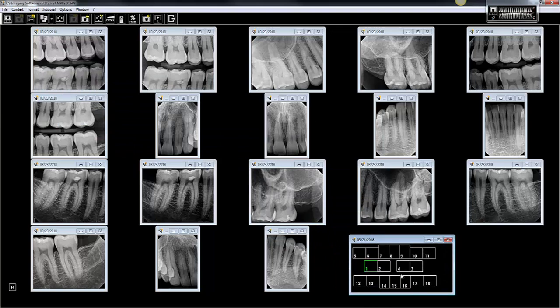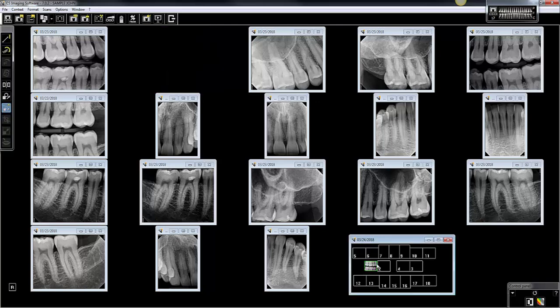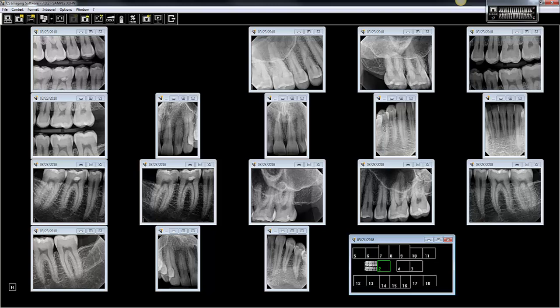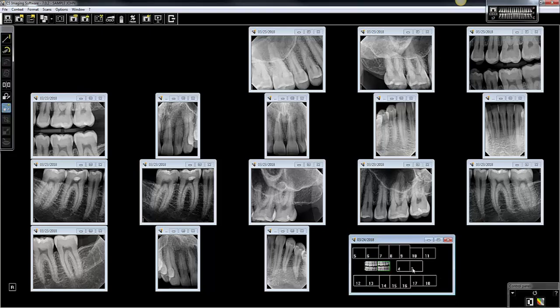Now, one at a time, we're going to drag each image into the format. Here's a tip you need to keep in mind: whichever position is highlighted — in this case it's number one — when you left-click and drag and drop an image anywhere inside of this border, wherever you let go of it, it's going to go into the highlighted position. So make sure you grab the proper image for the highlighted slot. Click on the next position, then go up and grab the image that needs to go in there, and so on.